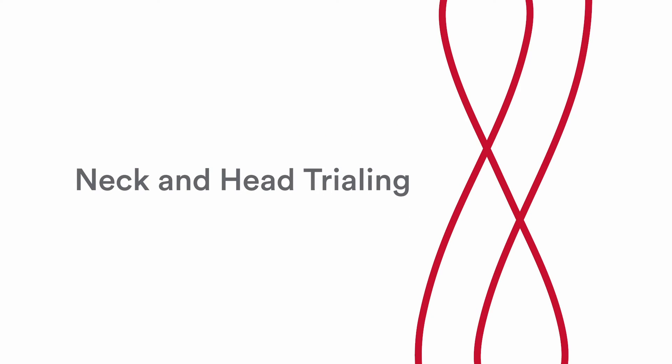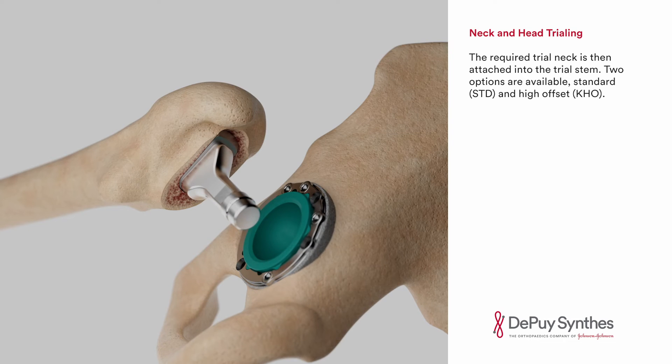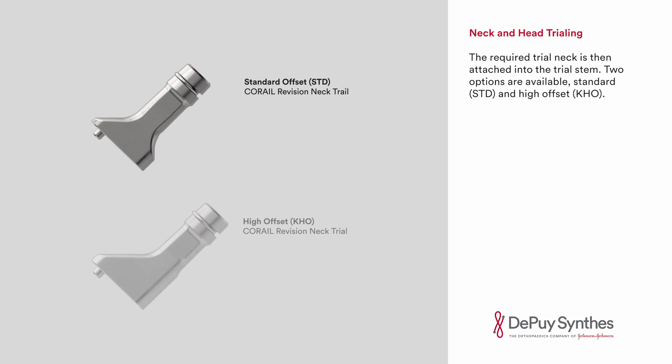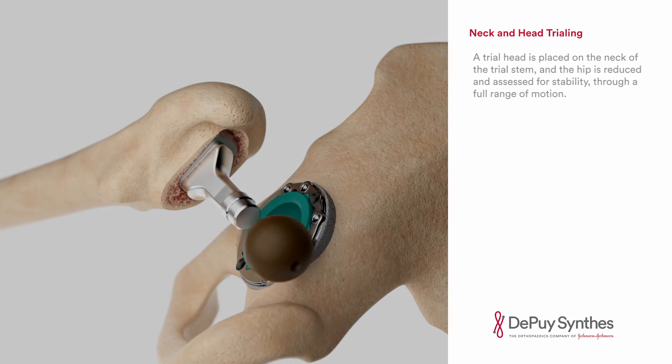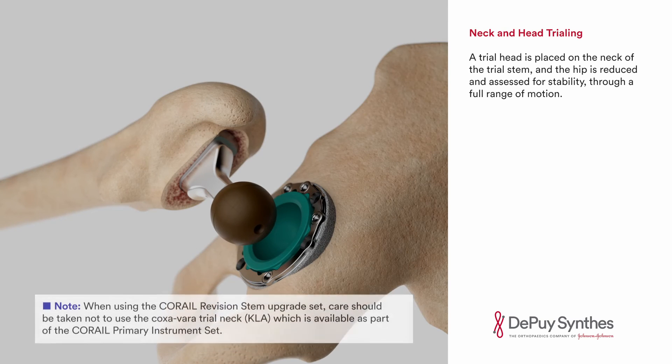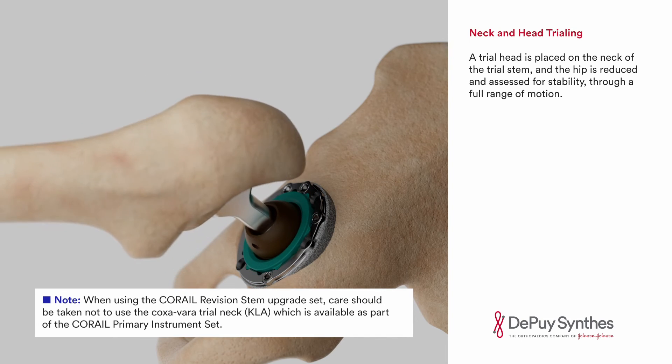Neck and head trialing. The required trial neck is then attached into the trial stem. Two options are available: standard and high offset. The high offset variant offers up to 7mm of direct lateralization depending on the size and will increase soft tissue tension without affecting leg length. A trial head is placed on the neck of the trial stem and the hip is reduced and assessed for stability through a full range of motion.